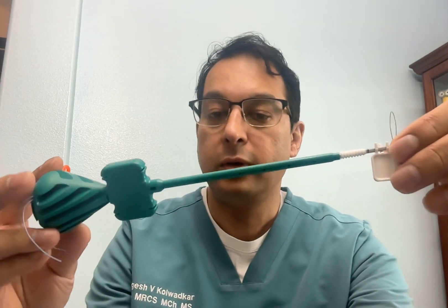Today I'm going to talk about the SwiftLock anchor, an Arthrex product. The anchor itself is made of biocomposite material. It has a tip with a hole through which the suture can be threaded, which is first passed through the rotator cuff and then through the anchor.